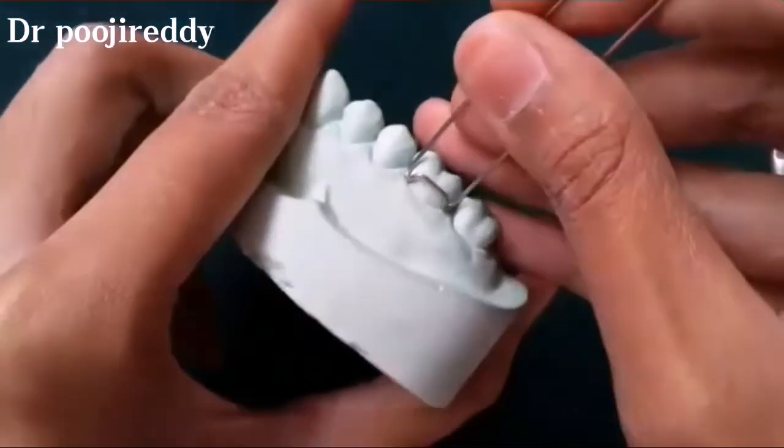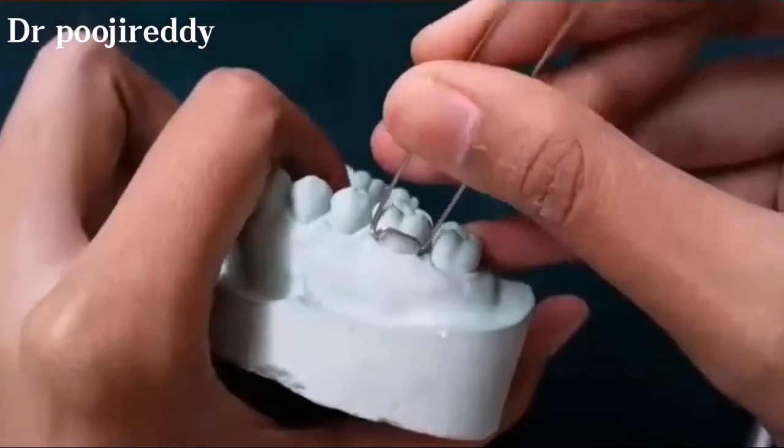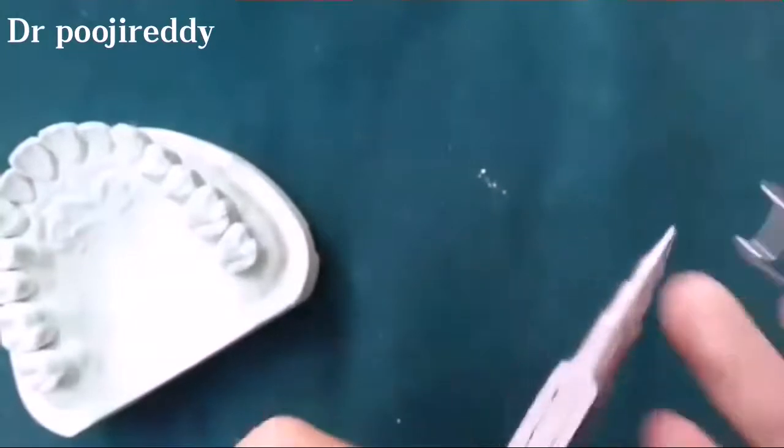Now place it in the cast and check before you proceed. After placing into the cast and confirmation, now we are good to go to the next step of the fabrication.